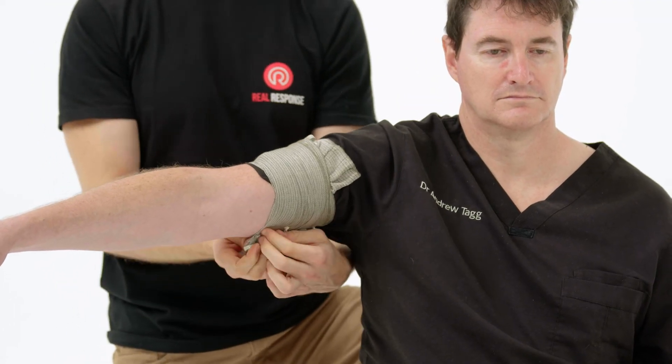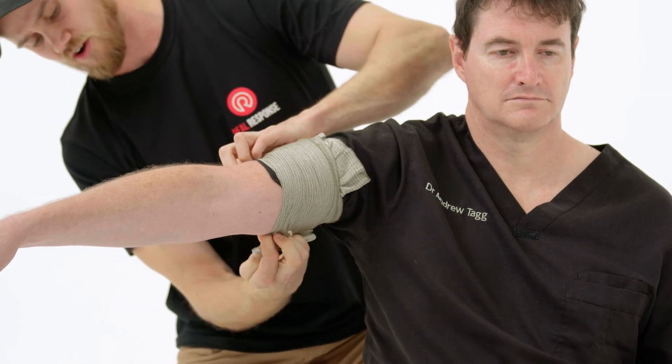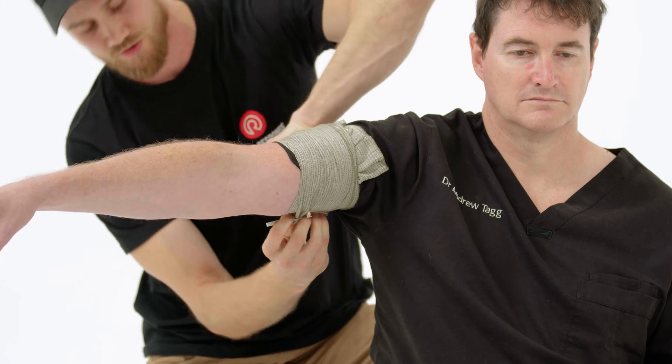Once you get to the end of the bandage, apply the hooks into the bandage itself, which will keep it in place and stop it from coming loose.